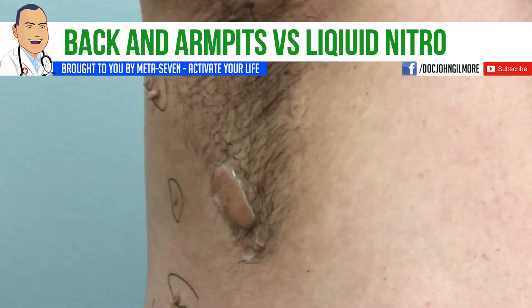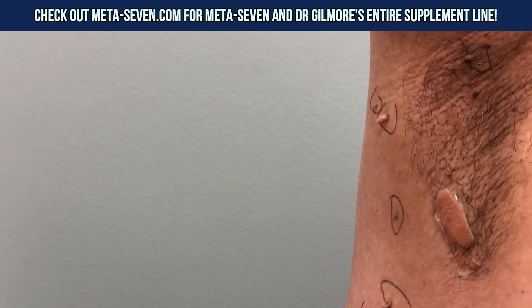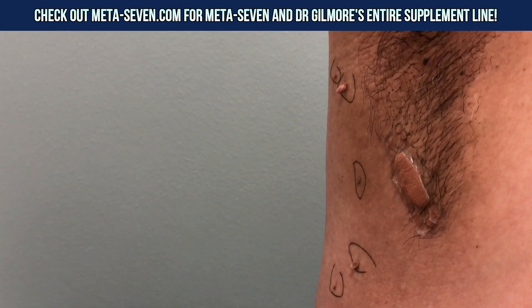Keep your arm up there — we've got these all circled that we're going to do. We're going to use liquid nitrogen, minus 320 degrees Fahrenheit. Did you know it was that cold? We're going to freeze all of these twice. They'll get kind of red and irritated, swell up a little bit for a few days, then they'll dry up and fall off.